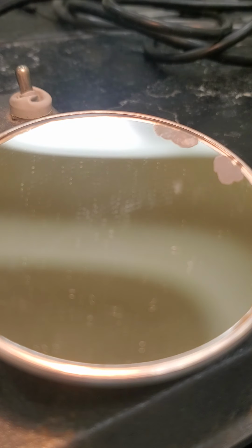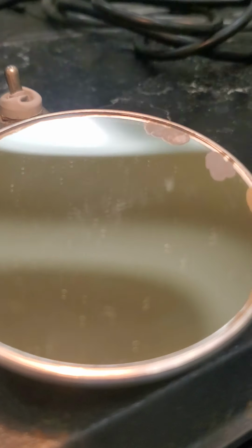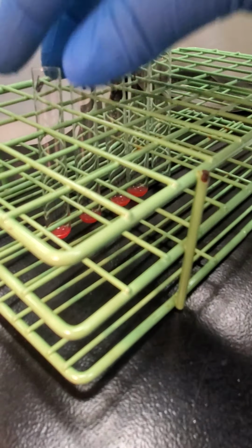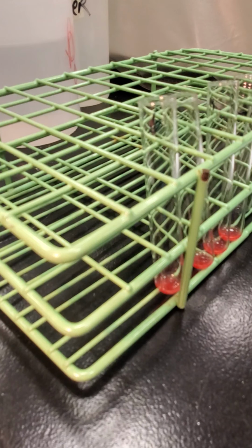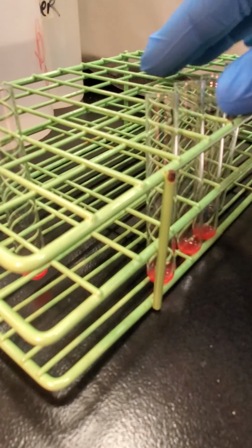Okay, so I'm going to get rid of tube 14. So I still have tubes 6, 10, 11, 12, and 13. So we're going to continue testing those. Let me just move these up. Okay, so tube 6, like I said, we're going to treat that as a weak D, so I'm just going to put that in the back.